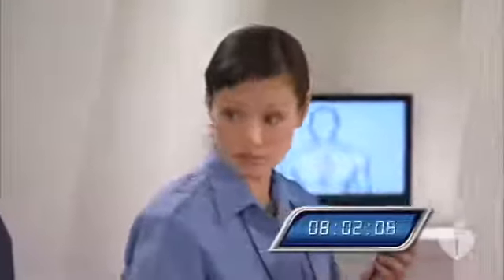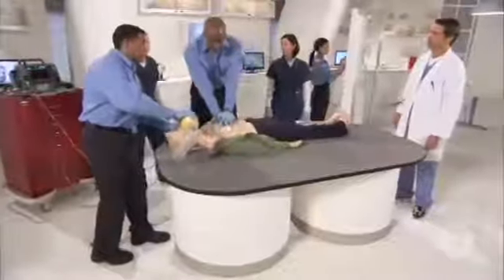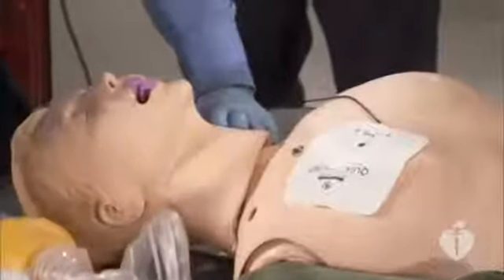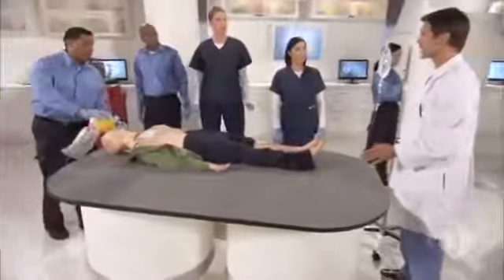2 minutes. Let's analyze, switch roles. Okay, the monitor shows sinus tachycardia. Sam, do we have a pulse? I can feel a rapid, weak pulse. Okay, great. Let's initiate immediate post-cardiac arrest care.